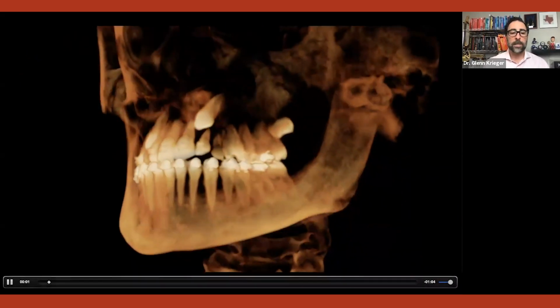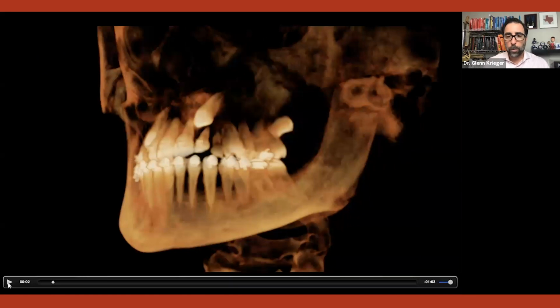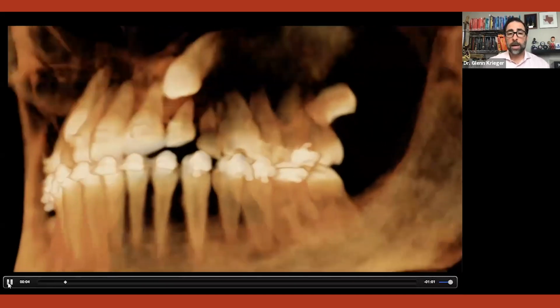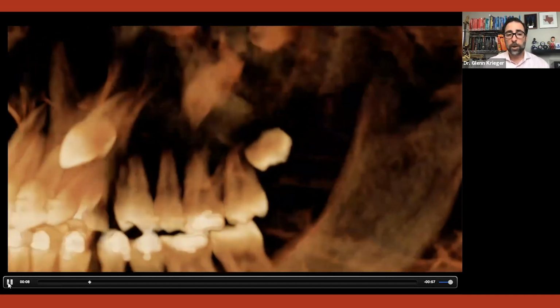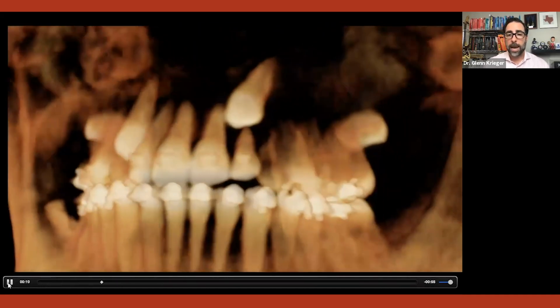Right, so now I've got separation, right? I truly have room between, without putting a bracket on that cuspid, I truly have room now between my lateral incisor, which I brought the root palatally slightly. I've created room around that to allow that cuspid some room to go distal, right? We can see the length of the root. We can visualize it. We can see what we really have.